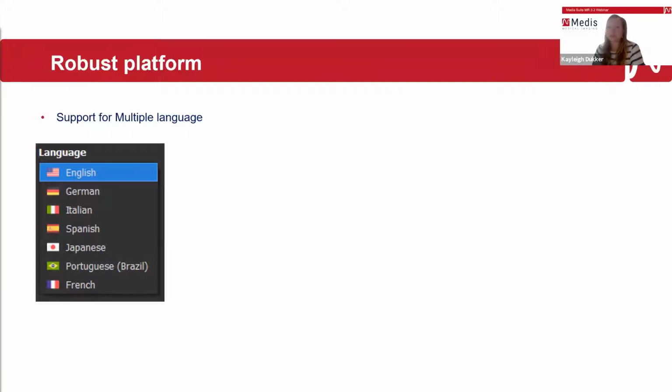To make sure that all our users understand the software, probably the majority did understand it in English, but we want to make sure that also in your mother tongue you can understand the software, and it will probably be a bit easier to grasp how the software is working and where to click, and what each functionality does, or what the output will be.